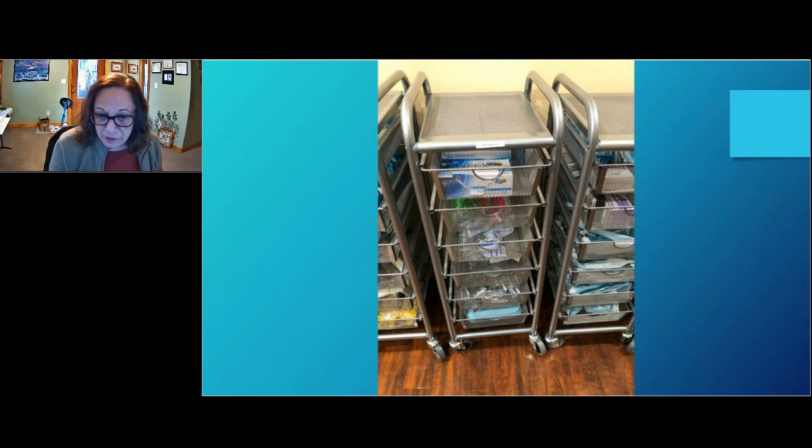At a minimum, I had recommended, these were specialty carts, and the specialists weren't always there. I had recommended they at least, if nothing else, the cheapest, easiest thing to do, not the best, but the quickest solution might be just to find covers for these carts and cover the carts so that dirt and debris and everything doesn't get in.